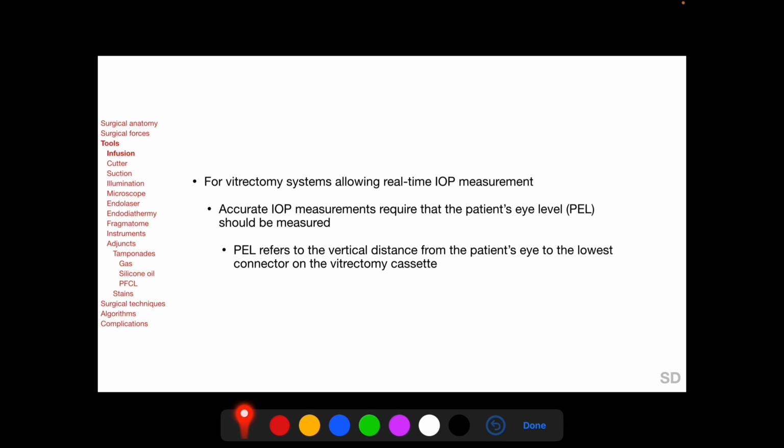Higher cutting rates have been achieved with dual pneumatic cutters, in which both the forward and the backward movement of the inner tube of the cutter is generated by separate air pulses in opposite directions, instead of the backward movement being generated by a spring, and with dual blade cutters, which have two pairs of cutting edges to cut in both forward and backward motion of the inner tube.